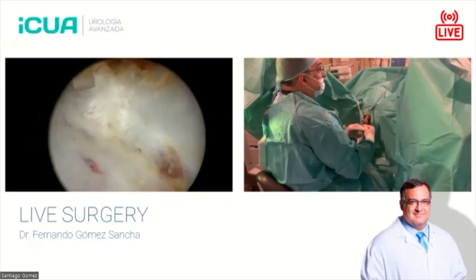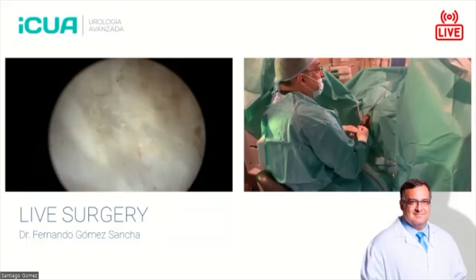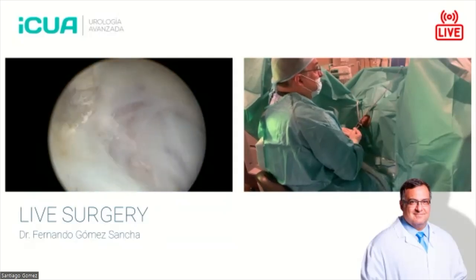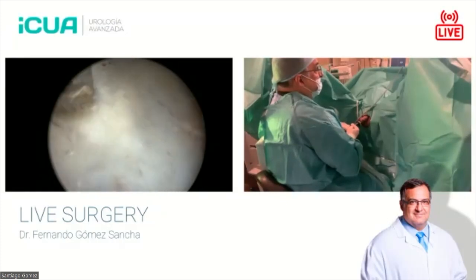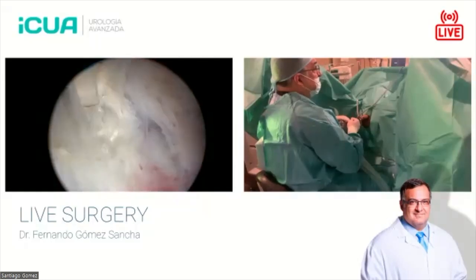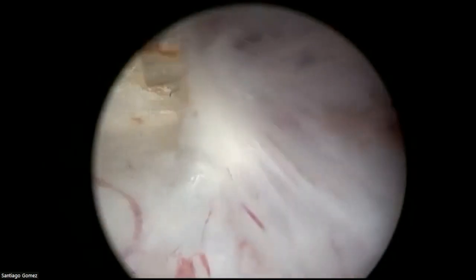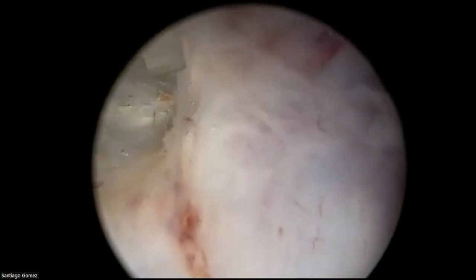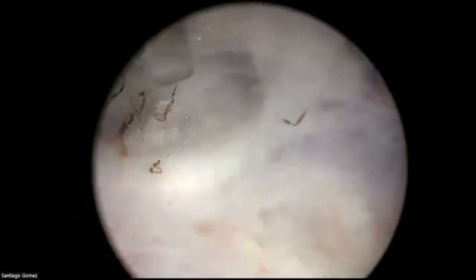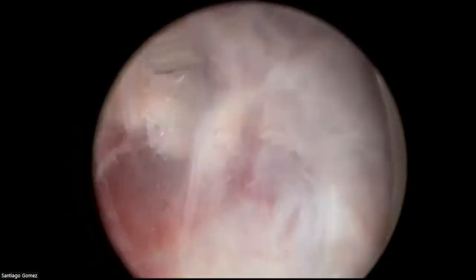Here, this is the posterior line connecting to the lateral line, getting closer towards the bladder neck, trying to follow my line, okay? So always connecting. Here, I'm trying to connect with the posterior line. Let's see where we are here. You see, this is the posterior line. Here, it's very beautiful. And I can even continue towards the other side. Maybe, you see, when we have these beautiful long lines, it's a pleasure to do enucleation.